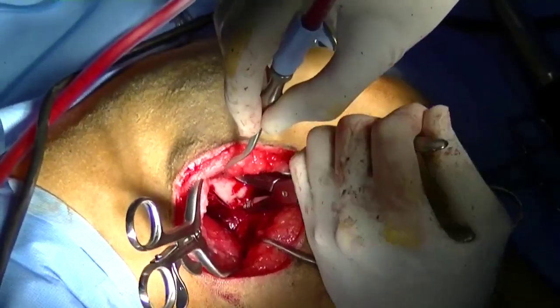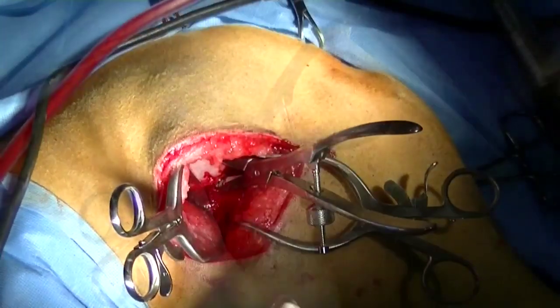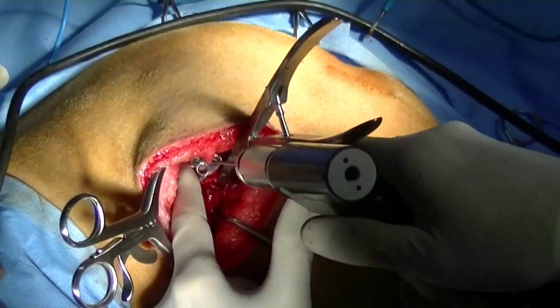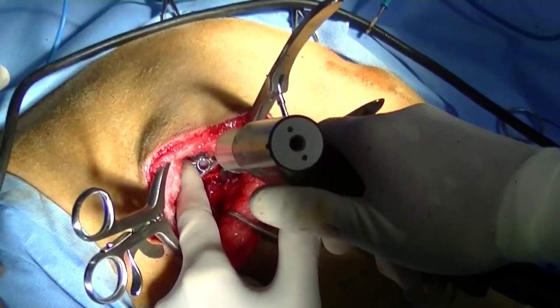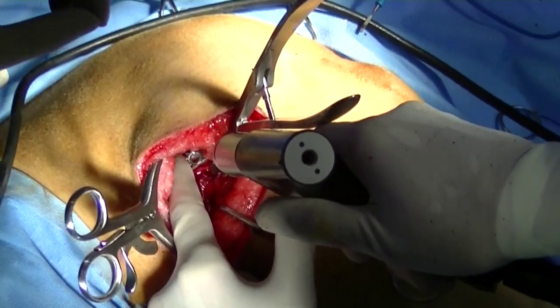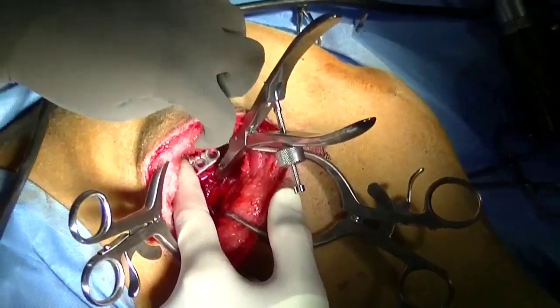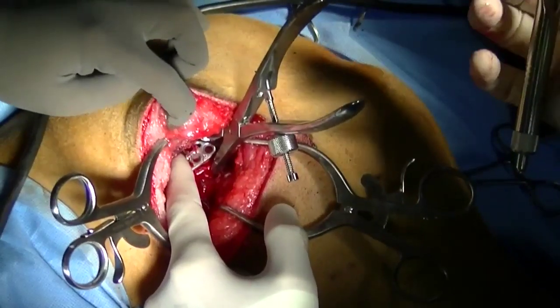I dislocate the caudal iliac segment once the cut is completed and then place the Slocum plate on the caudal segment first. I'm very careful to diverge the screws so that the forces are not concentrated on one small area of the medial iliac shaft. I use cancellous bone screws on the caudal segment and cortical bone screws on the cranial segment.